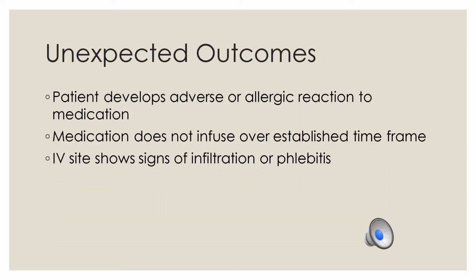Unexpected outcomes. If a patient develops an adverse or allergic reaction to a medicine when they're getting it intravenous piggyback or through the Volutrol or through the mini-infusion pump, you need to stop the medication and follow the policy for allergic reaction. And then we need to notify pharmacy if the medication does not infuse over the established time frame, so they might have to reschedule a medicine.